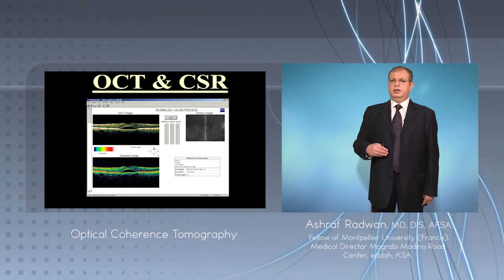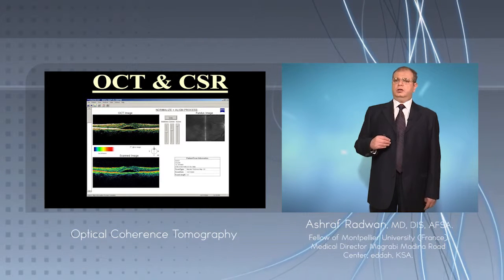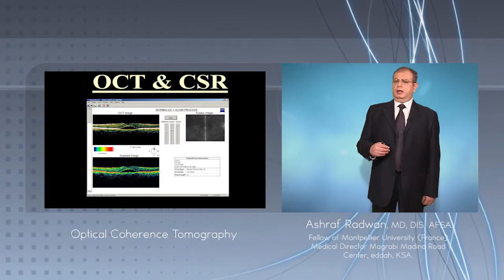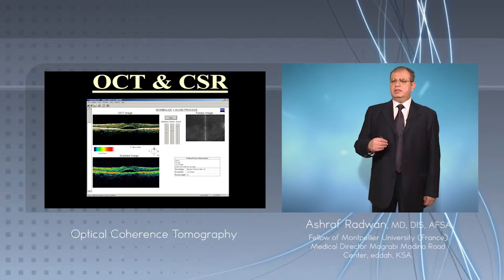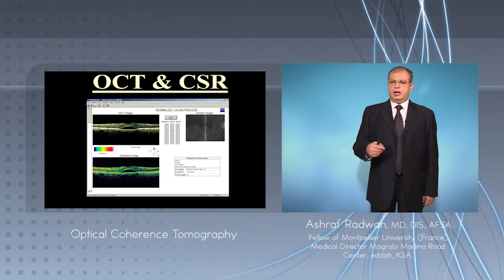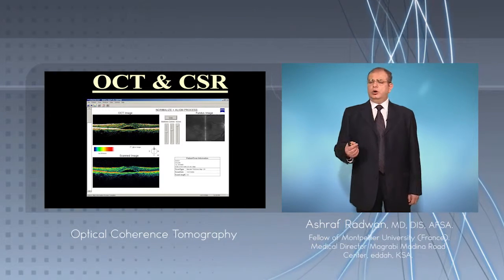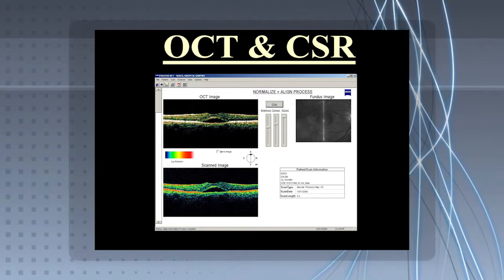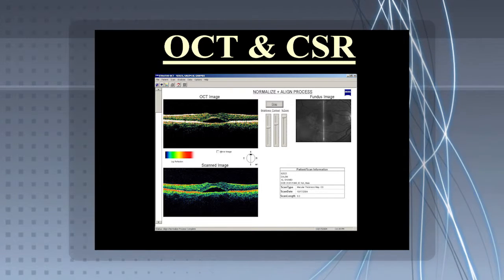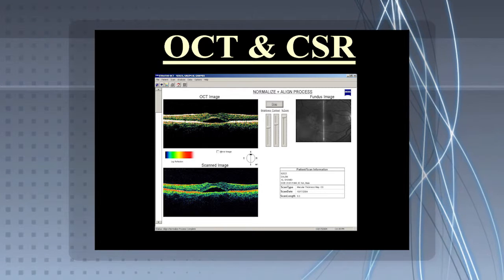It is a resolving central serous chorioretinopathy. So we can explain to the patient why he still has this decreased vision, that it will go with time with absorption of this fluid, or if it stays more than 2 months, it may need intervention by injecting this patient or by the use of micropulse laser.